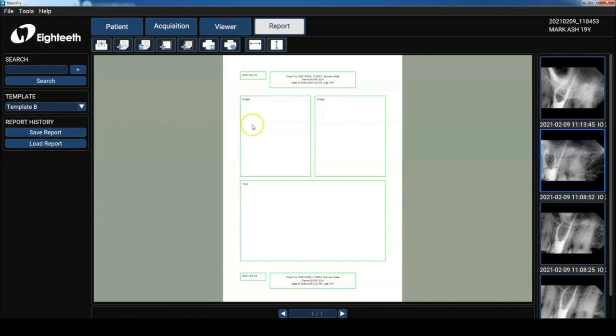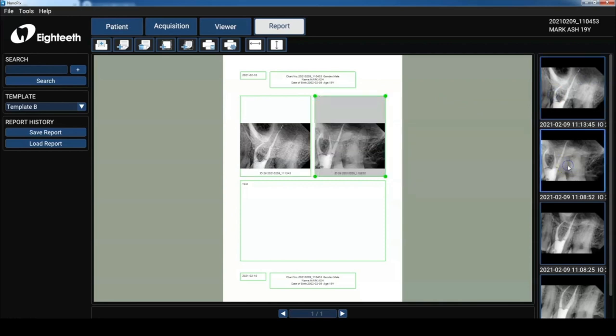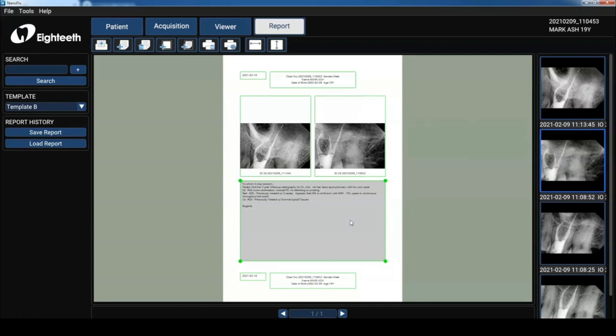So it's really simple to use. I'm going to click on the box or the images. I'm going to double click on the radiograph I want to put in there and that's it. I'm going to cut and paste some text that I've already typed up and voila, my report is done.